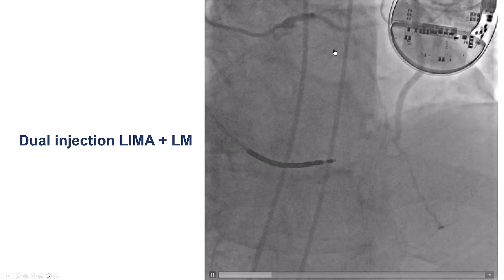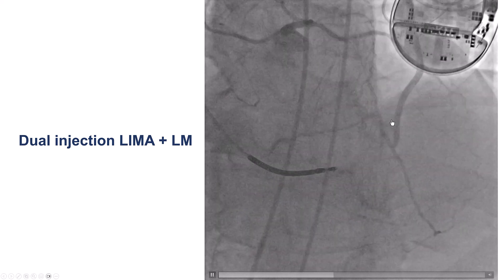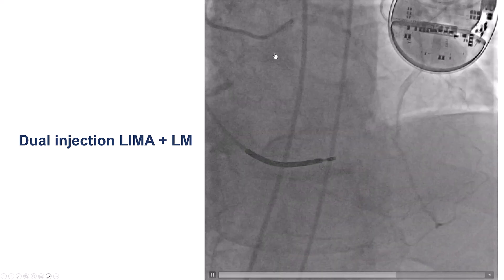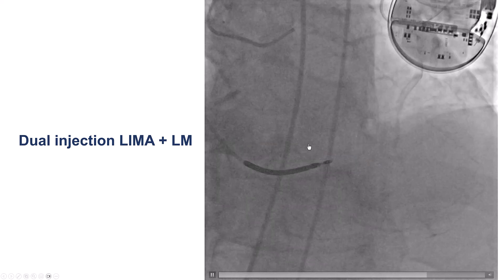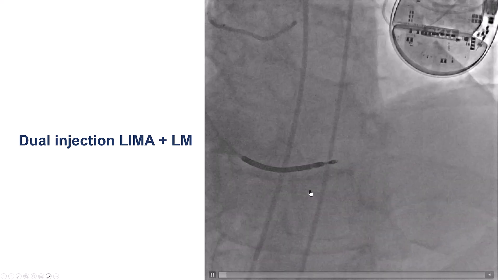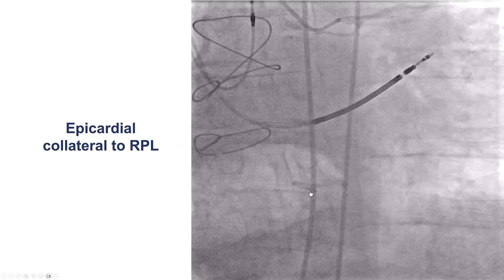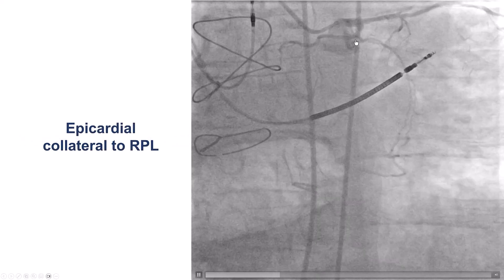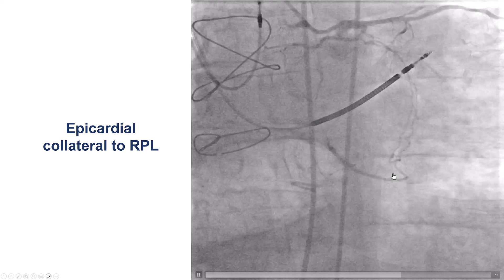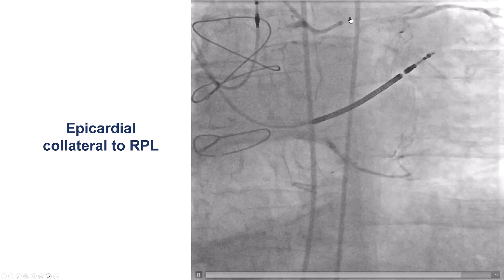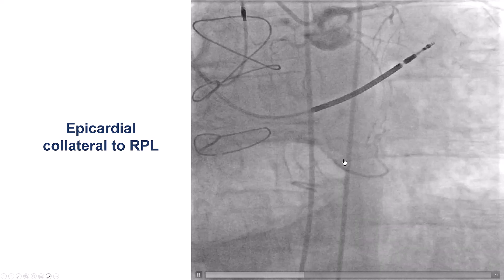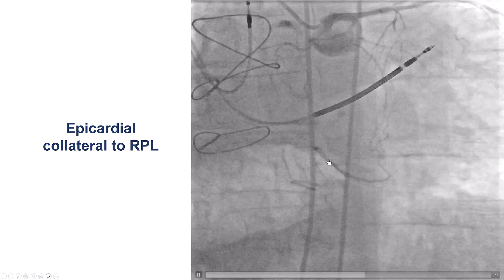The LIMA-to-LAD was patent and there was some collateral flow going to the posterolateral. This is a dual injection from the LIMA as well as the left main, showing the filling of the right posterolateral as well as the PDA. There was also an epicardial collateral coming from the left coronary system via the circumflex going to the posterolateral.